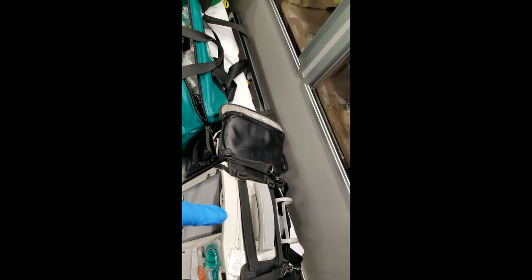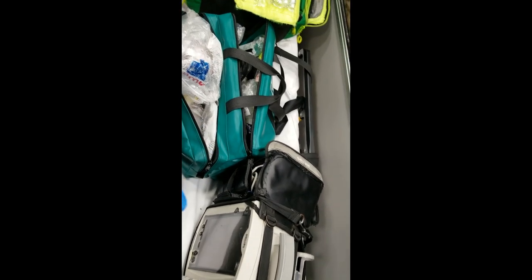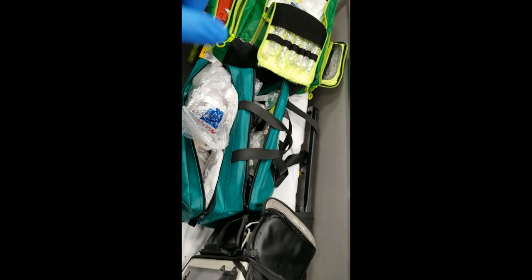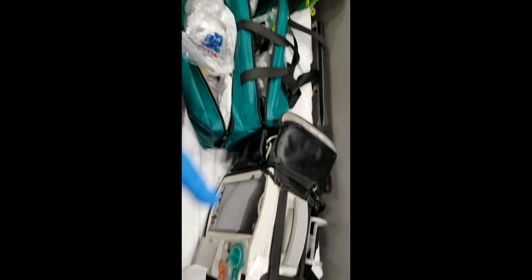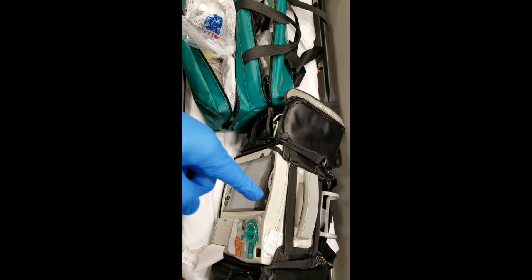That's our bags on every single job — the ALS response bag, the O2 bag, the cardiac monitor, and transport equipment. When it's BLS, you bring O2, a response bag, an AED, and transport equipment. Since ALS is pretty much the same thing, instead of an AED we bring the cardiac monitor.